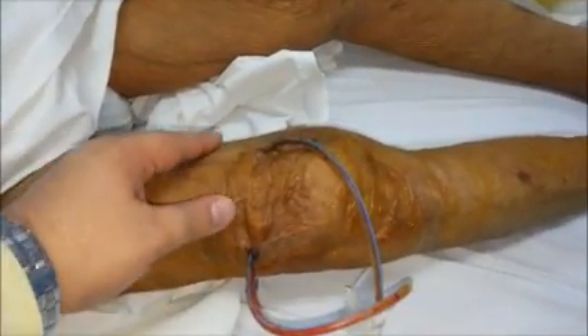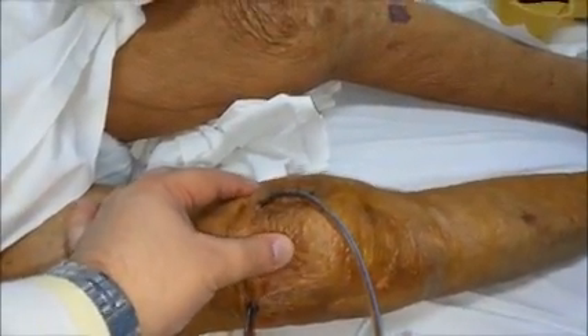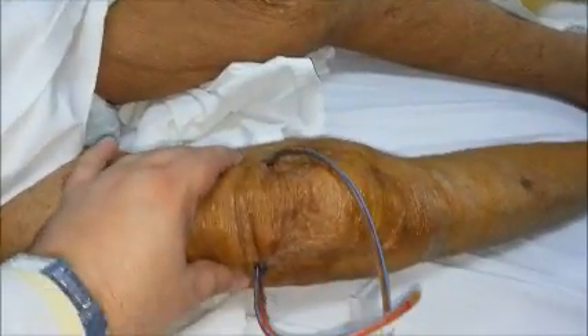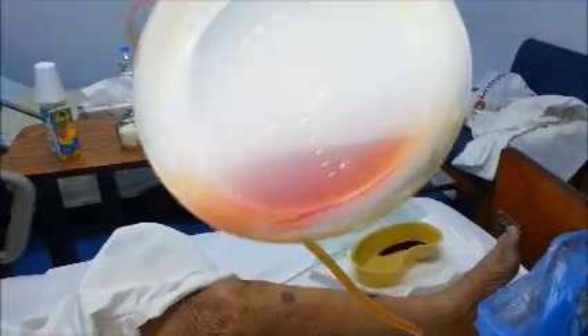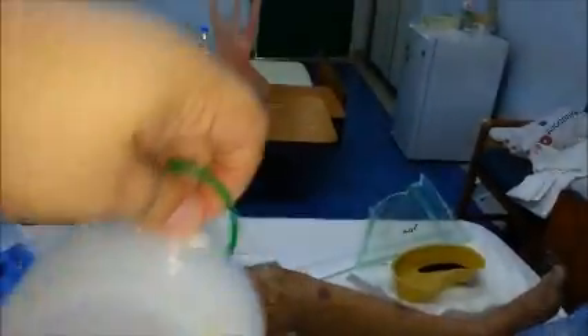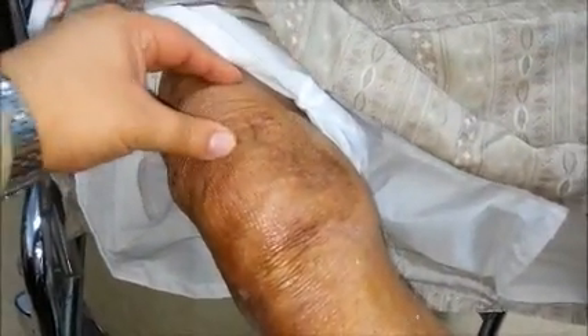Check out 48 hours post-operative: as we see, the knee is completely deflated, there is no fluid inside at all. This is the Redivac drain — we did not empty it since the operation. Now, after five days from the operation, there is no effusion at all — it is complete resolution. Thank you.